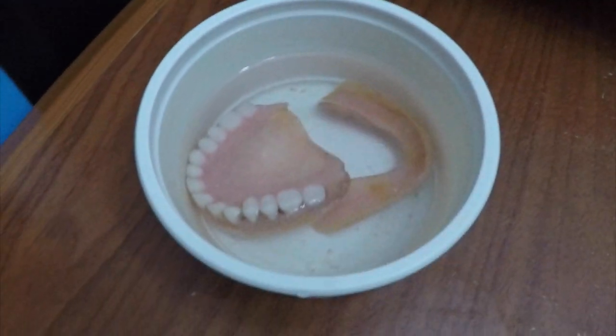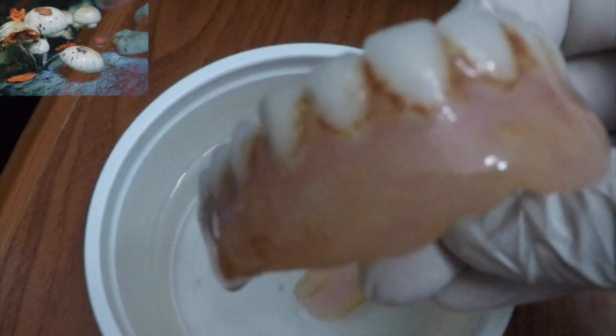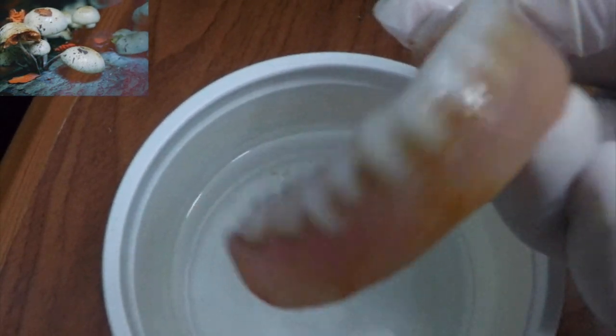We are demonstrating using a denture which is around 25 years old. This patient has been ill for quite some time and the denture was not maintained. There is a lot of external growth seen on the denture, which is totally unhealthy for the patient. Before the patient can resume wearing the dentures, it is advised that both the upper and lower dentures are cleansed. Microscopic growth is evident on this particular denture.